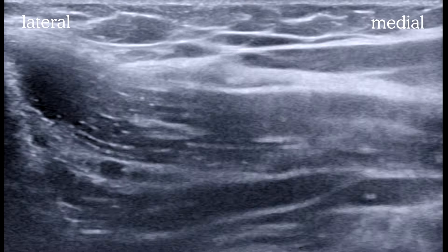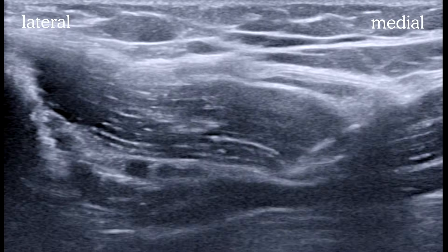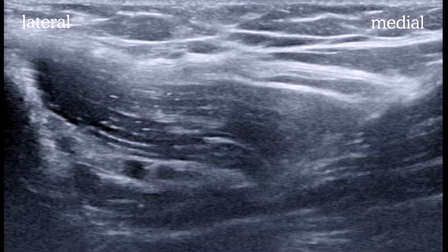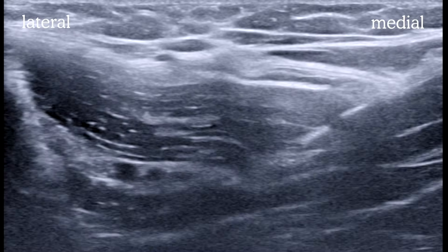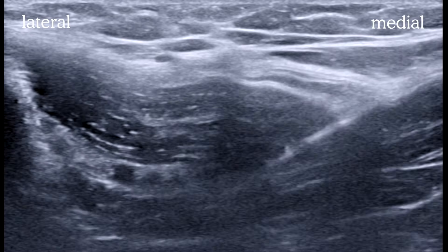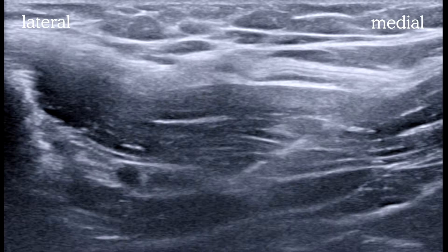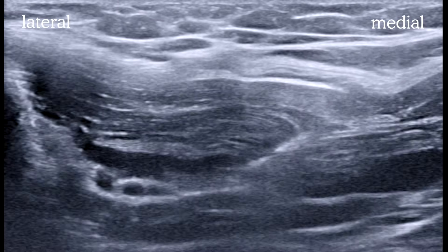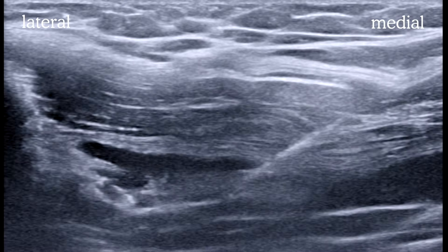Here we see the internal oblique, transversus, and the ASIS on the lateral side. You can see the nerves and vessels appearing like three peas in a pod. We're going to bring the needle in-plane from medial to lateral. The needle passes through the muscles and approaches the fascial plane beside the neurovascular structures. A test injection shows the tip is still in the internal oblique — we need to advance one more click. Now we see the local anesthetic immediately next to the nerves, pushing up the internal oblique muscle. You can see how 10 mils spreads easily to cover all the possible anatomic variations within that plane.